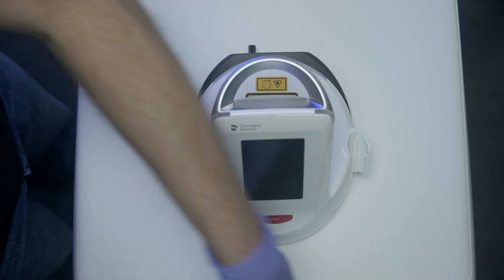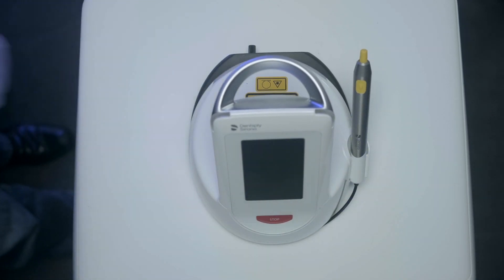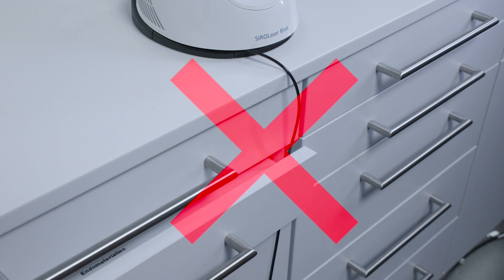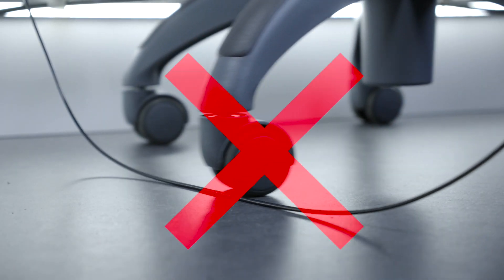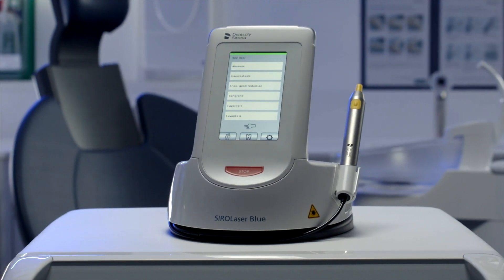The cable is flexible, but remember that there is a very thin glass fiber inside, so always handle with care. For example, when the cable is unwound, make sure that it's not trapped in a drawer or run over by the wheels of a stool or cart. Please note these instructions to protect the optical system of the Ciro Laser Blue.